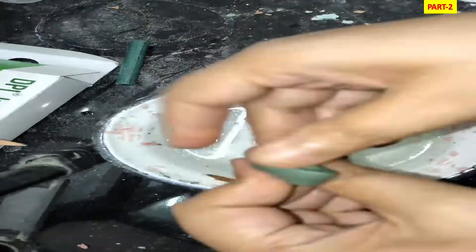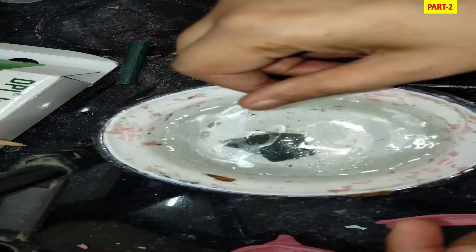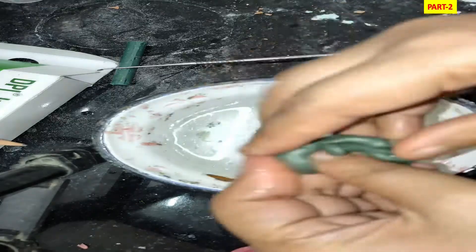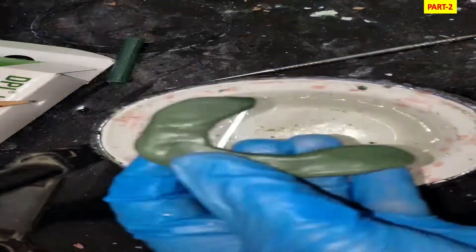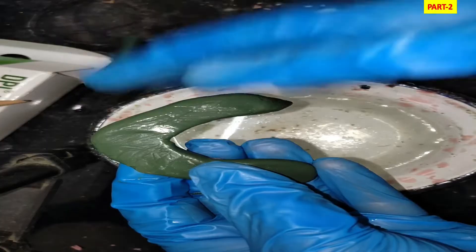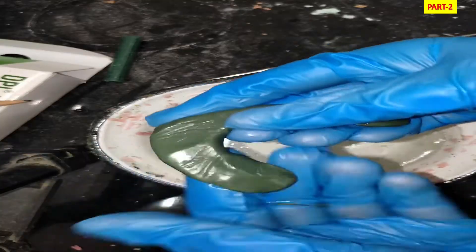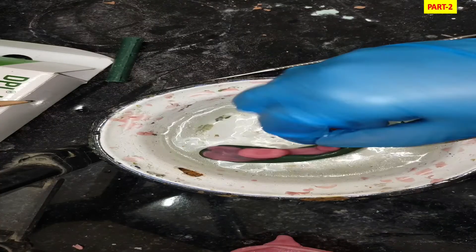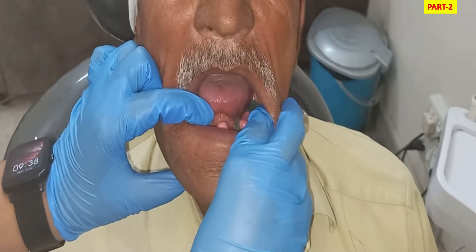We knead the 3:7 mixture until we get a homogeneous mass, which provides a working time of about 90 seconds. This homogeneous mass is then loaded onto the tray, and with the help of the thumb we press the material into the tray so it takes the proper shape. After checking the temperature, we place the loaded tray in the patient's mouth and advise tongue movement to record the borders.